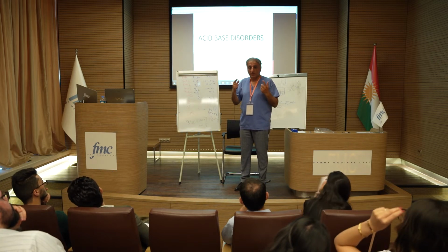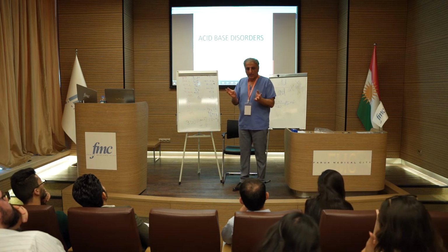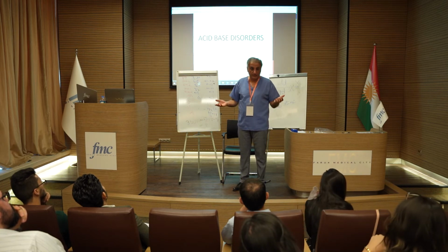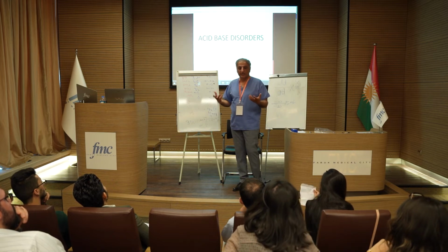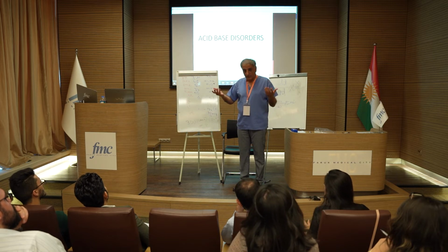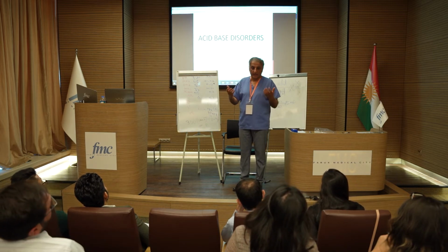So if you analyze the whole picture, she's a long-term COPD patient. So probably she's somebody who accumulates CO2, has CO2 retention, and compensates for that with high bicarb.